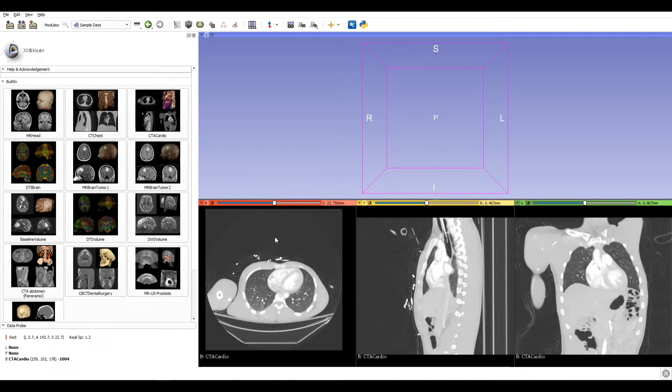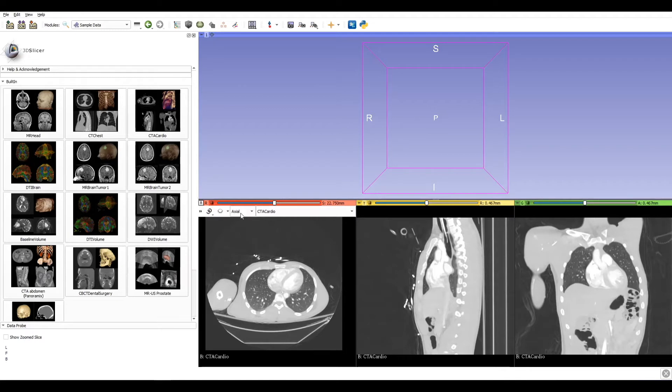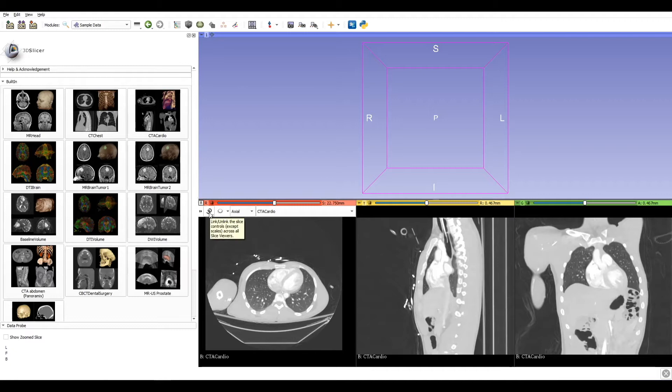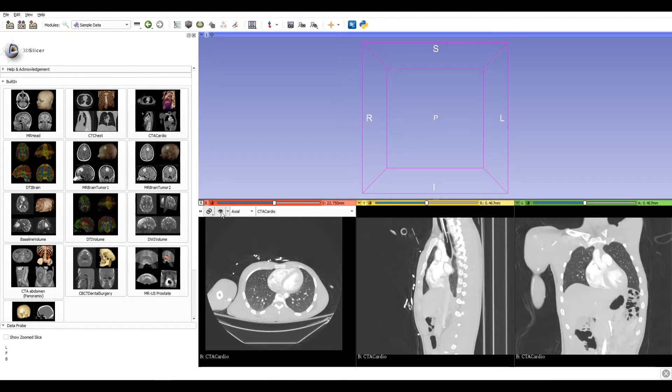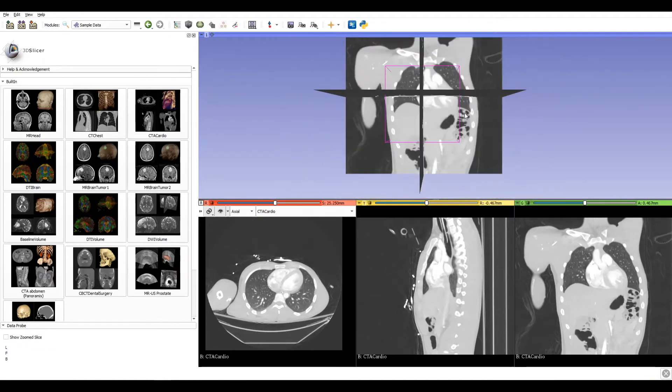On the top left of each view, we can find a little pin icon where we can see which orthogonal view we are in and which dataset we are working on. With the chain icon, we link the three views. And with the eye button, we can see our slice in the 3D space.